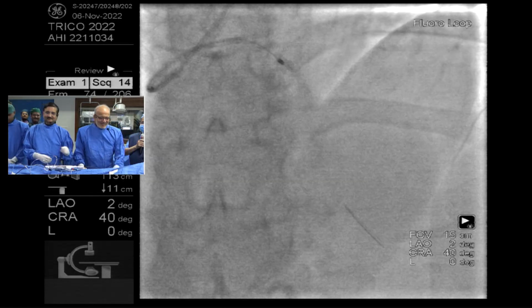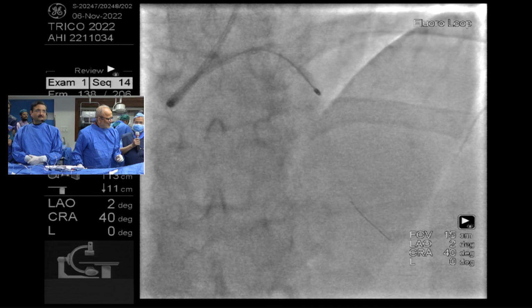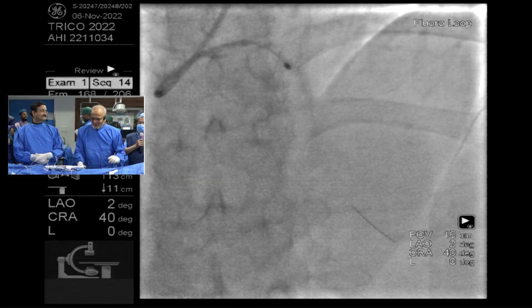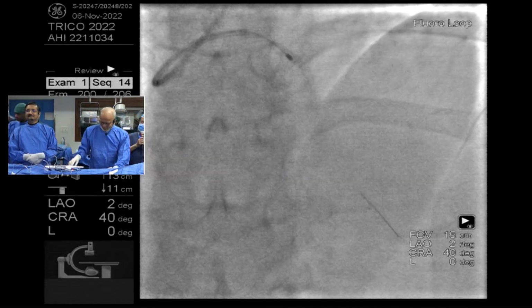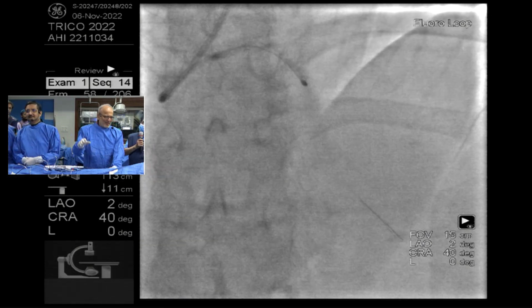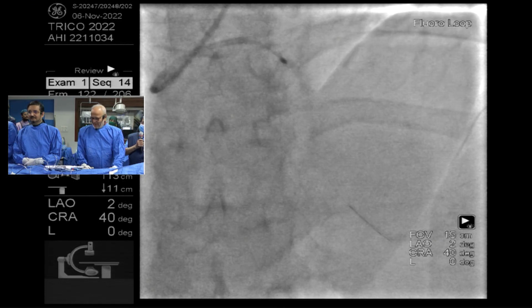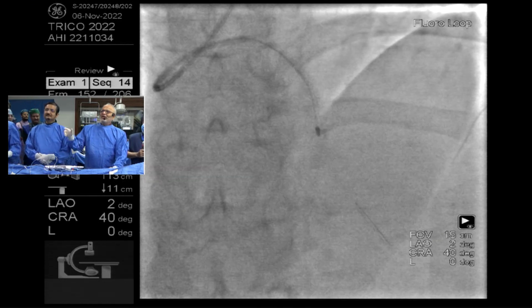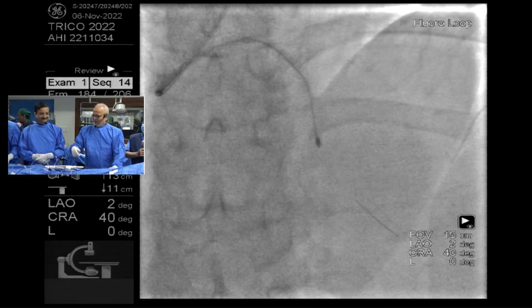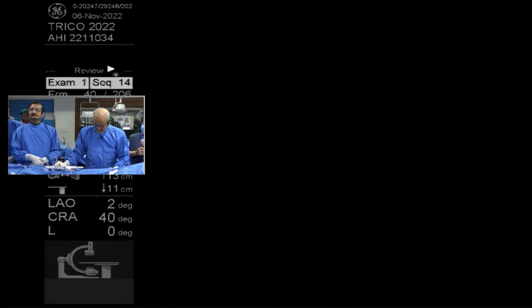So 1,80,000, Dr. Akasaka, it is Japanese, yeah. We usually do 150. I learned rotational atherectomy from Professor Samin Sharma way back in 95, and he will be very unhappy seeing me going for 1,80,000, because he taught us one more pass, yeah, quick.